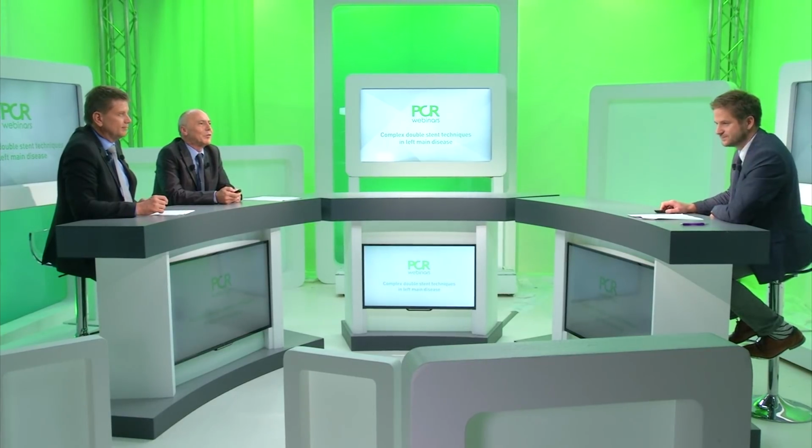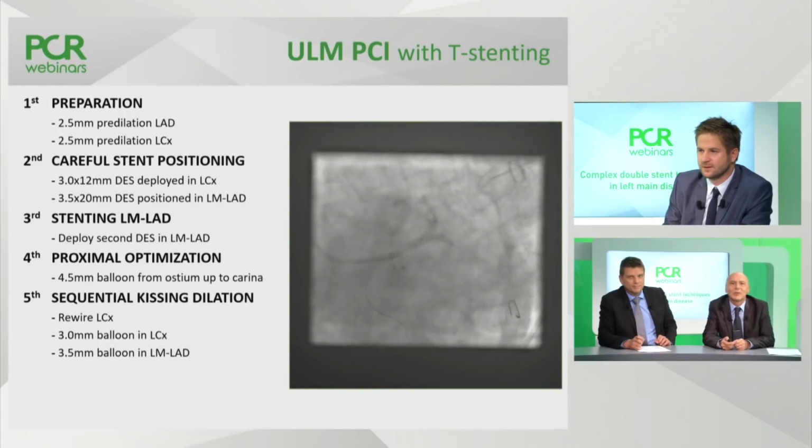Okay, POT is done, side branch, main branch stented. What's next? So the next was rewiring. After the POT, it was quite easy to get with another wire to the circumflex.